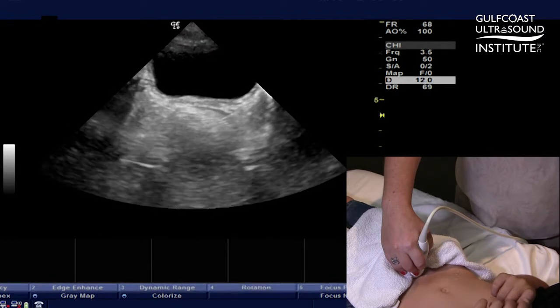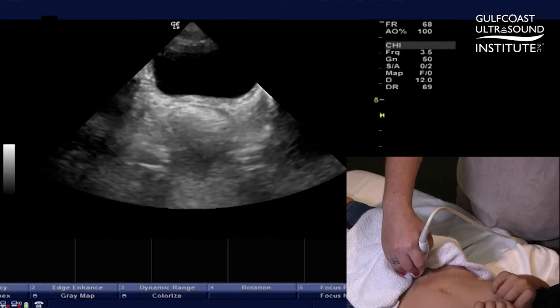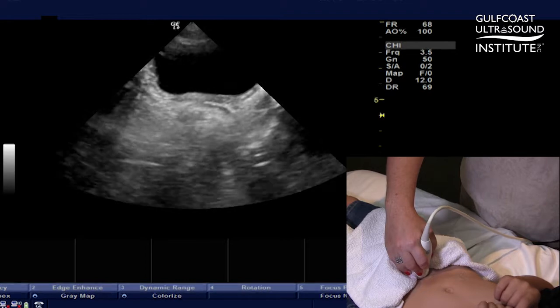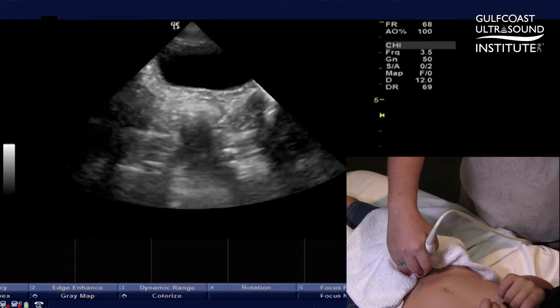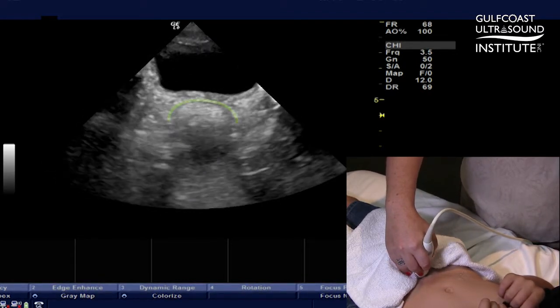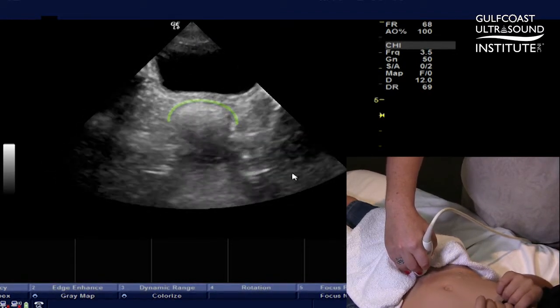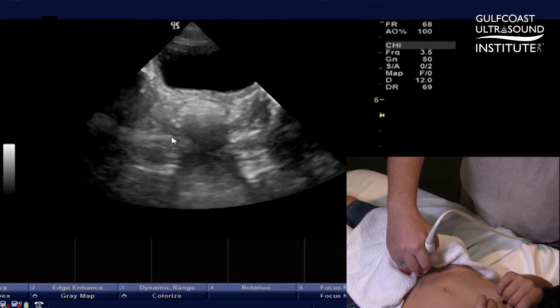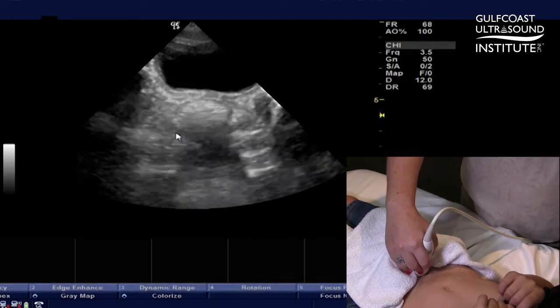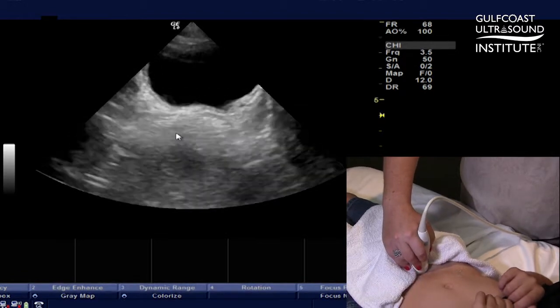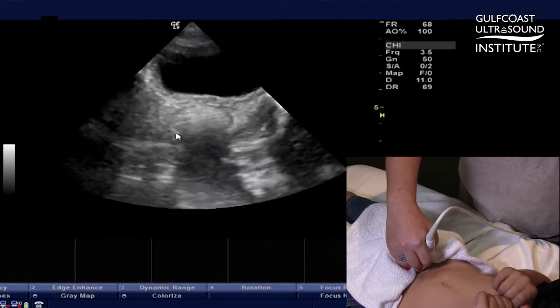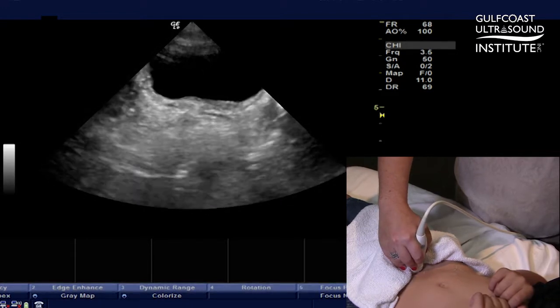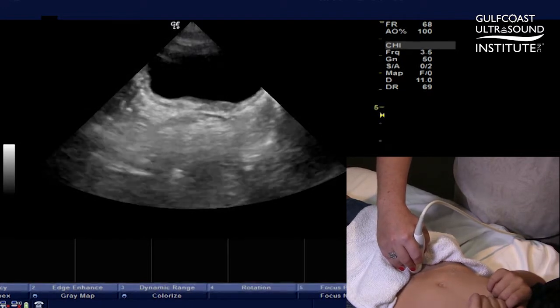I'm going to decrease the far gain because it's too bright, and what I'm going to look for is the rectal crescent. I fan through, and we have this rectal crescent right there — that is the rectum. You fan through to find the region where that crescent is the largest, and then freeze that image.